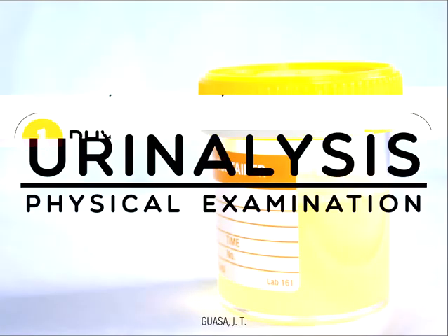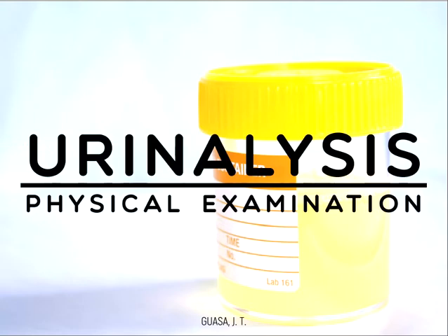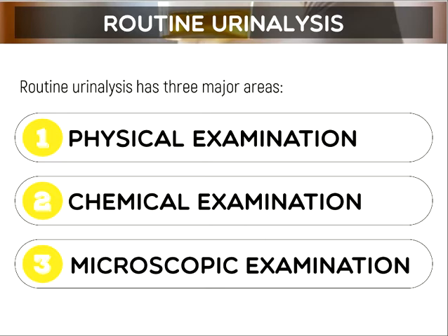Routine urinalysis has three major areas. We all know the physical examination, then we also have the chemical examination, and lastly, the microscopic examination. As I said earlier, today's topic will just be part 1 of the routine urinalysis.